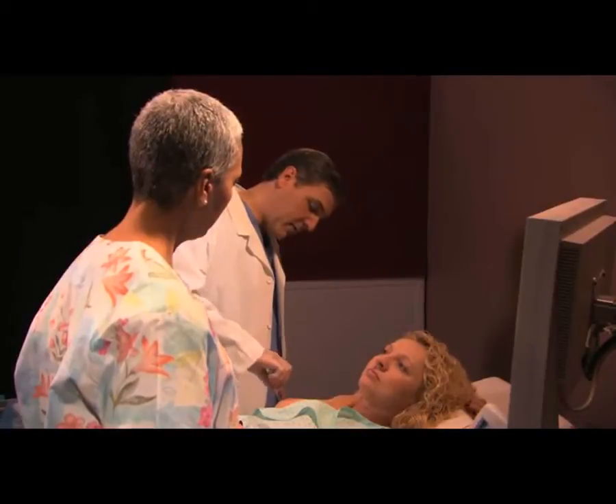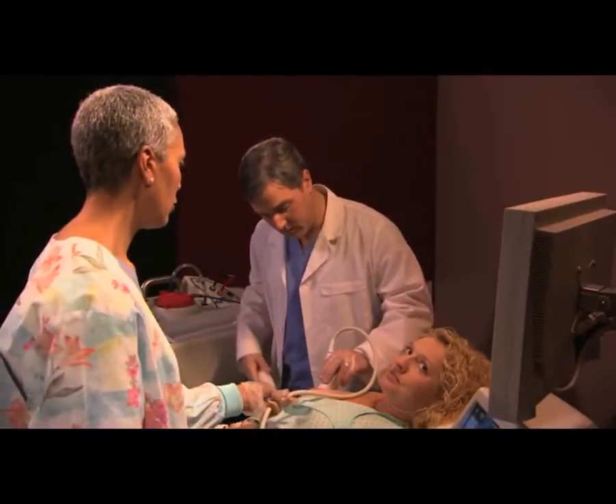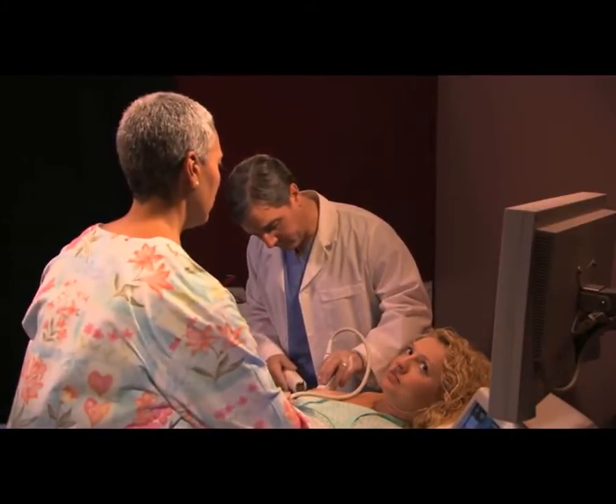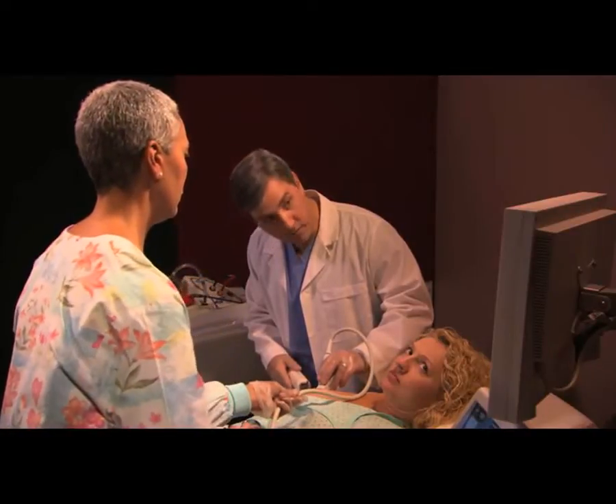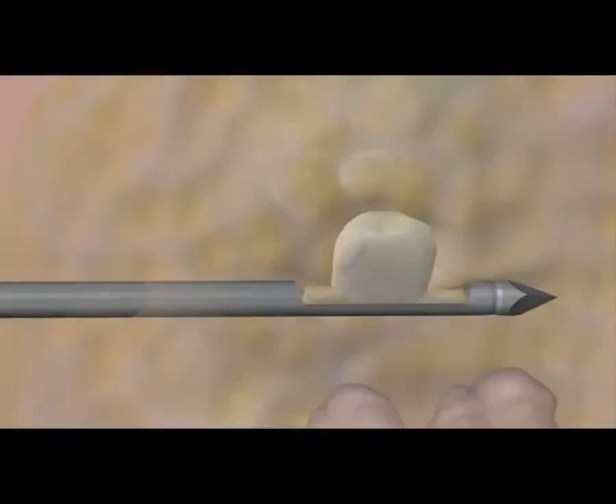Next, your breast will be cleaned and numbed prior to making a small incision. Vacuum pressure is used to take out the sample, flushing the area with fluid at the same time. Using the ultrasound image as a guide, the tip of the biopsy device is inserted into your breast, and they begin to take the tissue samples.